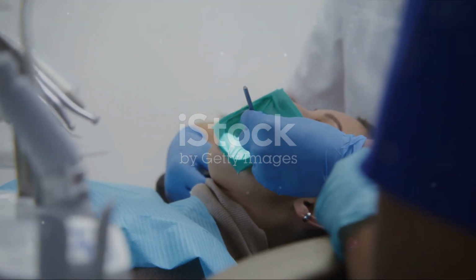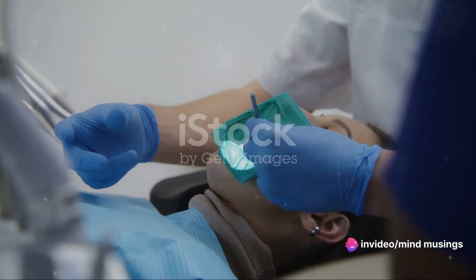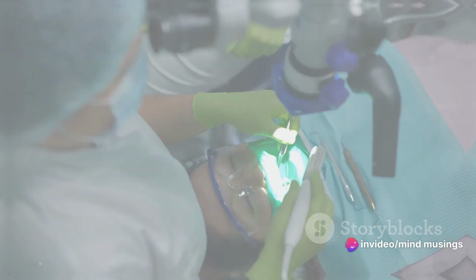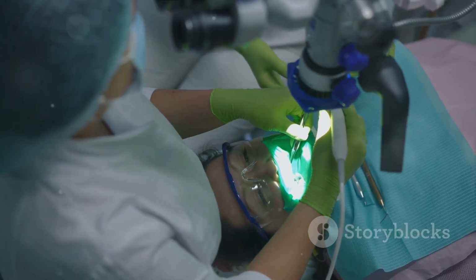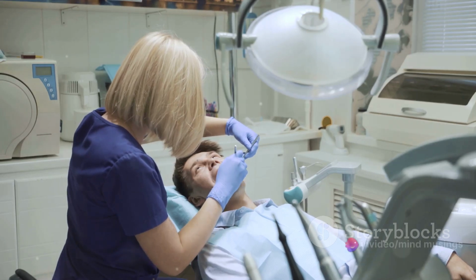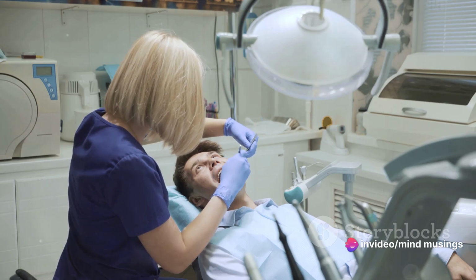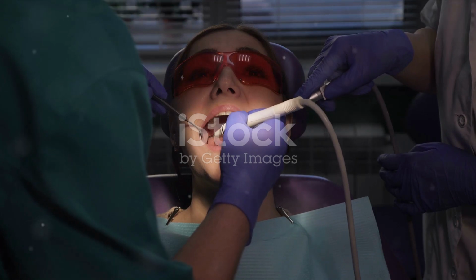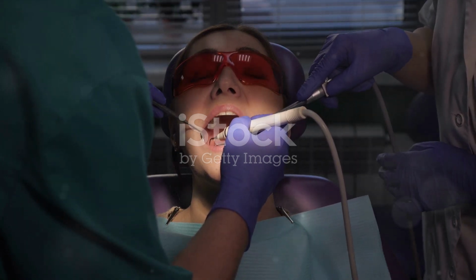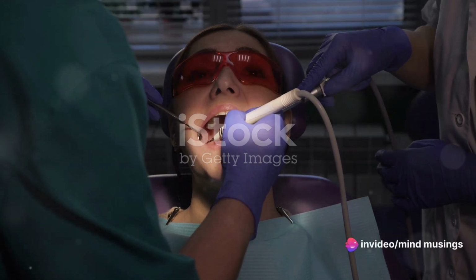The patient is then scheduled for a follow-up appointment to assess the results and plan further treatment if necessary. To summarize, a test cavity in endodontics is a diagnostic tool used when other vitality tests are inconclusive. It involves drilling a small hole in the tooth to the level of the dentin to test the pulp's vitality. The patient's response to sensation is crucial in determining the health of the pulp. Remember, the goal is not to expose the pulp, but to get close enough to test its vitality.